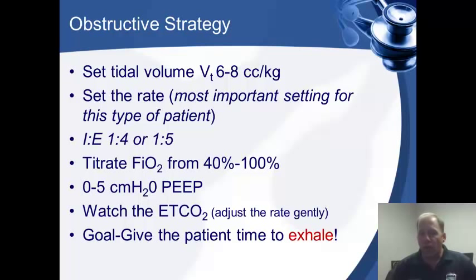We're going to titrate our FiO2. We'll start with 100%, but about 5 minutes or so, we're probably going to drop that down to about 40 to 60% and see how our patient's doing. You may or may not need PEEP. I probably wouldn't start out with any PEEP on most of these patients unless they were having oxygenation problems. If they were, then I would probably start increasing it from about 3 centimeters of water to maybe 5 at the most and increase my FiO2 to a point where I get better oxygenation.